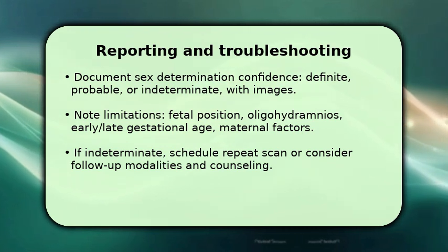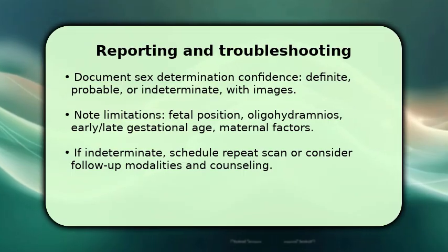And give one troubleshooting tip. If poor visualization, reposition mother and request feedback.